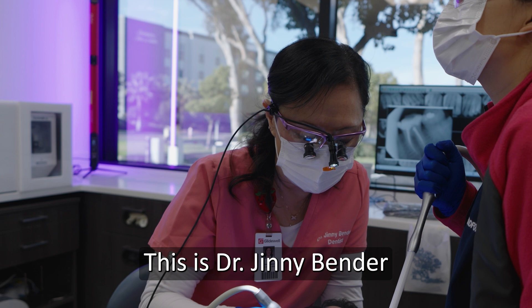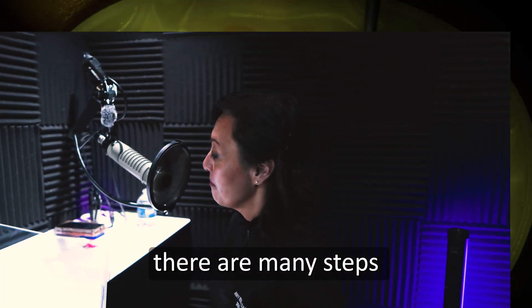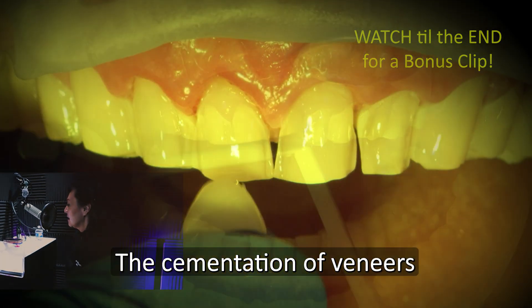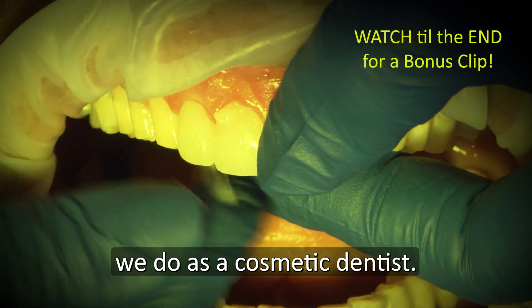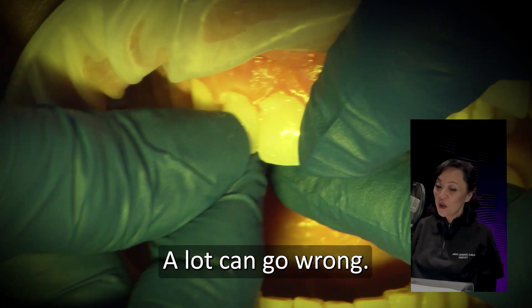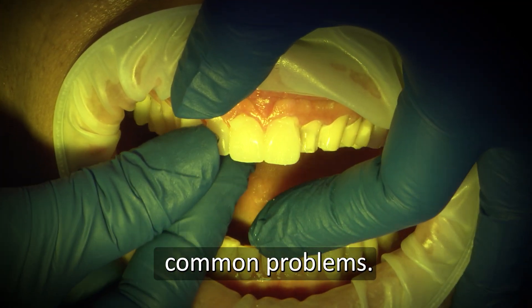Hi there, this is Dr. Ginny Bender from Glidewell. For aesthetic veneer cases, there are many steps that lead up to the finish line. The cementation of veneers is probably one of the scariest things we do as a cosmetic dentist. A lot can go wrong, so let's go through the protocol and learn how to avoid common problems.